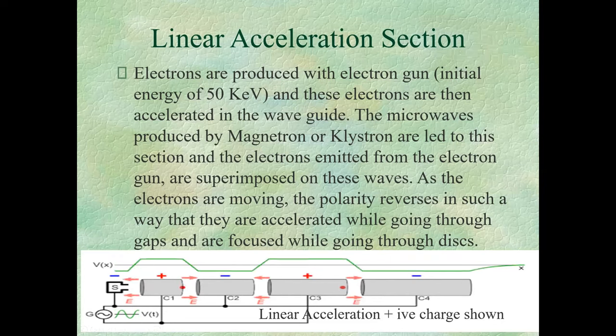So you may just remember the electron gun picture that we just saw. It's similar, but believe me, these are different. These are made of tungsten. This is not a mesh like the electron gun. It's kind of a solid disc here in these areas.